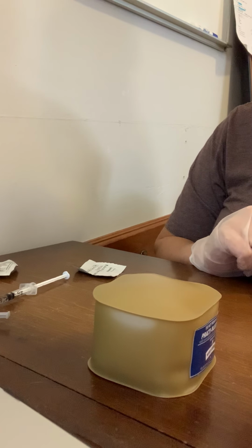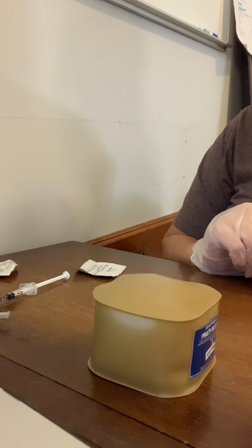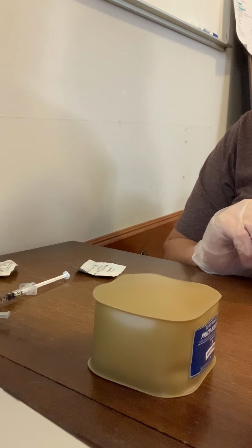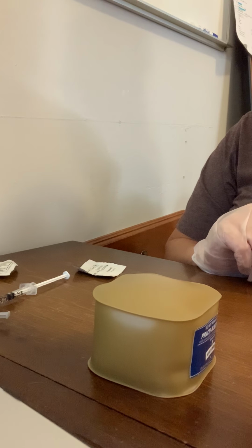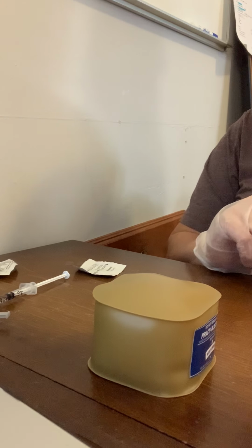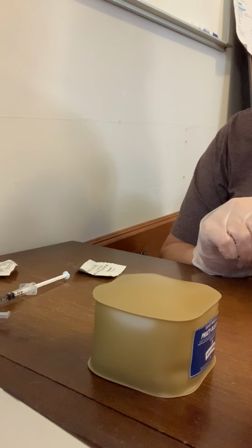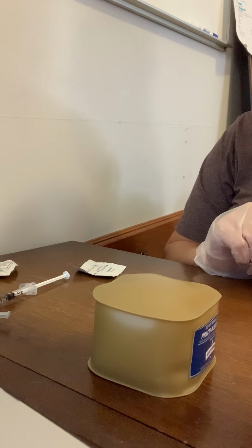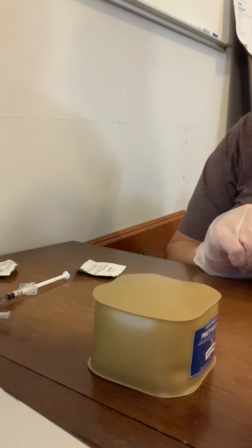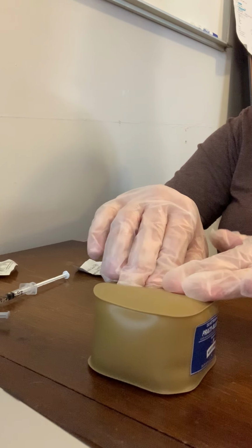The next, my sub-Q injection. I have 2 appropriate sites, which would be 2 inches to the left or right of the umbilicus, or the upper lateral of the arm. So I'm going to assist my client into a comfortable position. I will inspect and palpate for bruises.